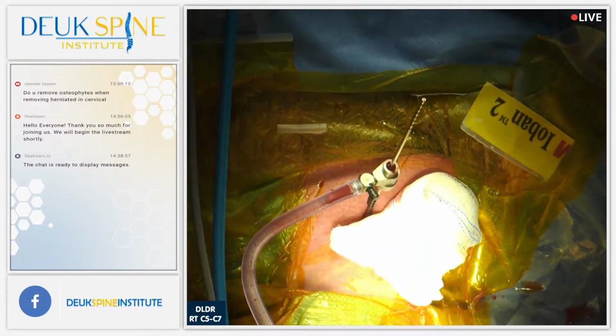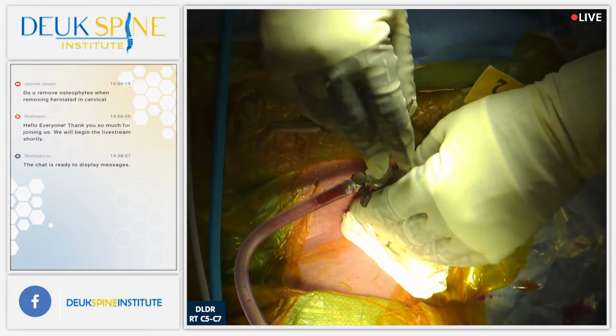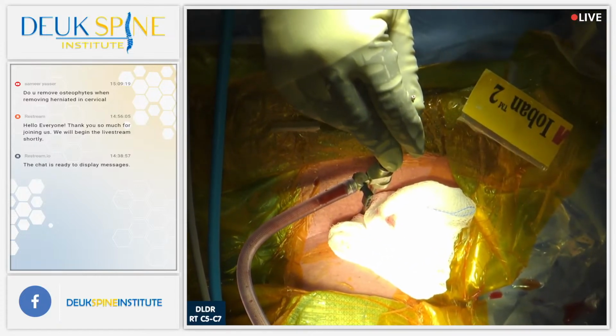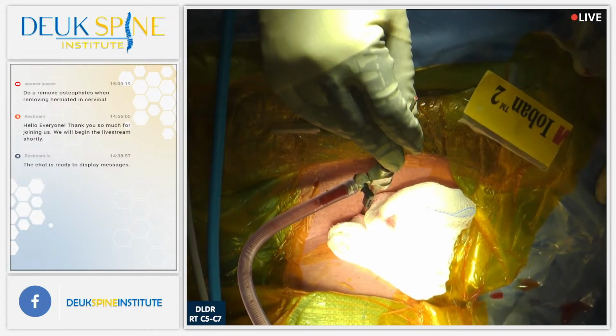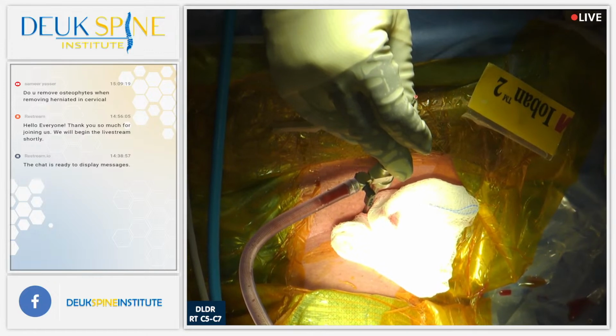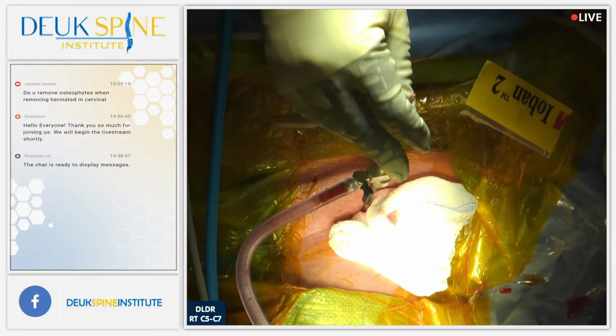Can I get a towel? I've got sweat over here. Thank you. All right, it's going to take our concerted efforts. I do need head inline traction. I'll need a shoulder pulls, and I'll try to do lateral, but I may have to go just with AP.